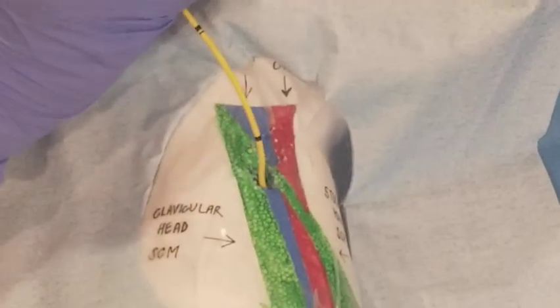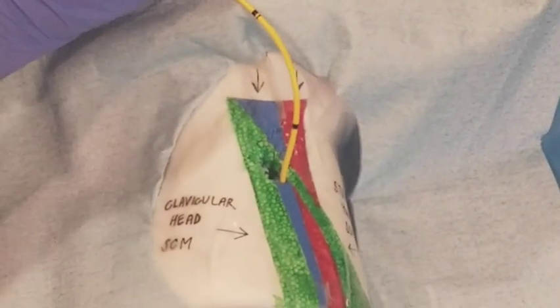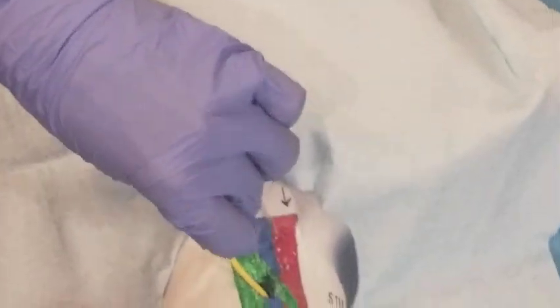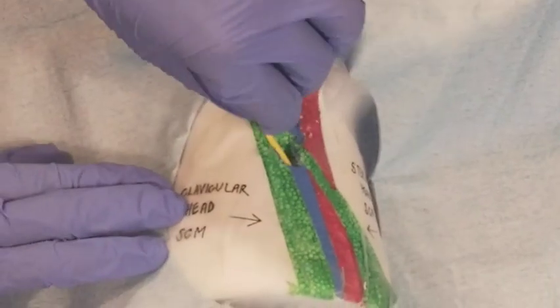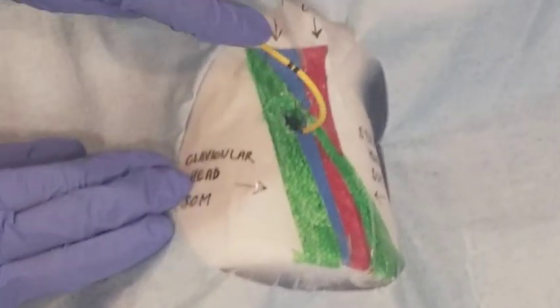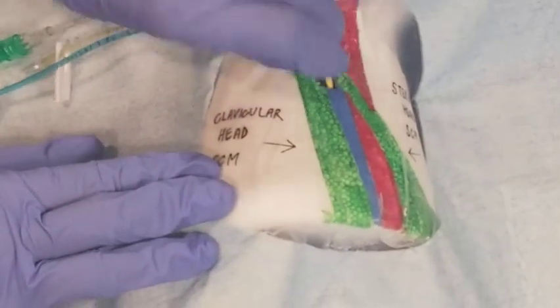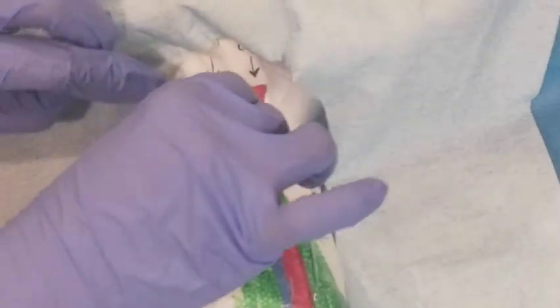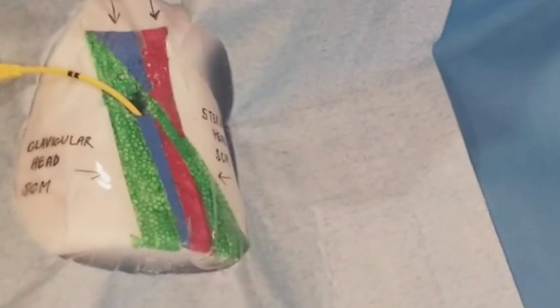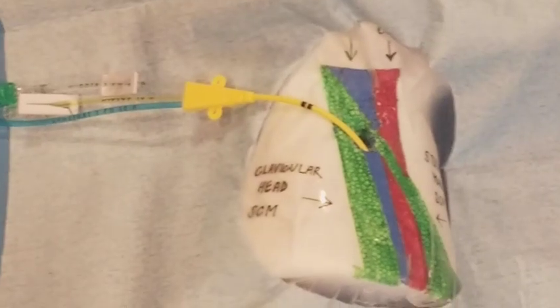Now you can remove the wire after the catheter has been placed into the vein, and you want to insert it up to the double black lines. Since this is a model, I'm just going to push the catheter in at the desired length. On a real person, you wouldn't do that. Now the double black lines is where you want to secure the fasteners so that the line cannot be removed even if the patient pulls it.